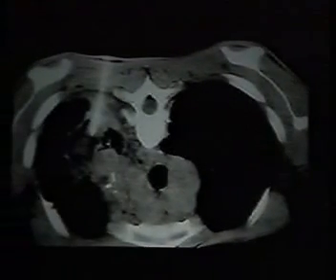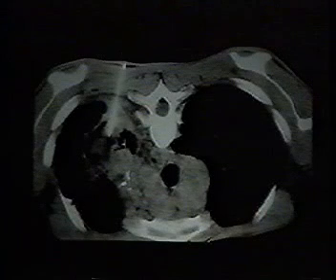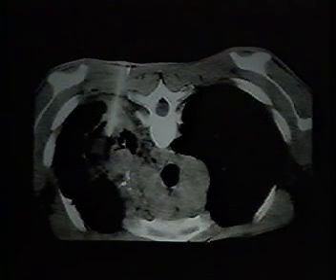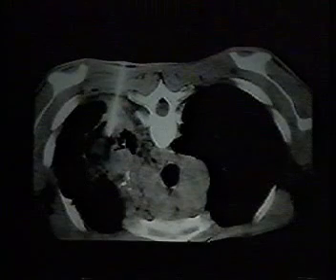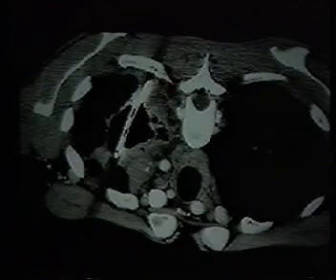What we chose to do, because we really didn't have any other options, was bring the patient to CT. And using the CT image to go through an area of pleural thickening, we placed a needle into the cavity, and then using fluoroscopy, we placed a pigtail catheter into the cavity surrounding the aspergilloma, which you can see right here, going through the pleural chest wall surface and surrounding the mycetoma. And here you can see after 14 days of intracavitary amphotericin B, the patient had no further hemoptysis, and you can see that the cavity is now empty and the aspergilloma has been evacuated via the catheter.